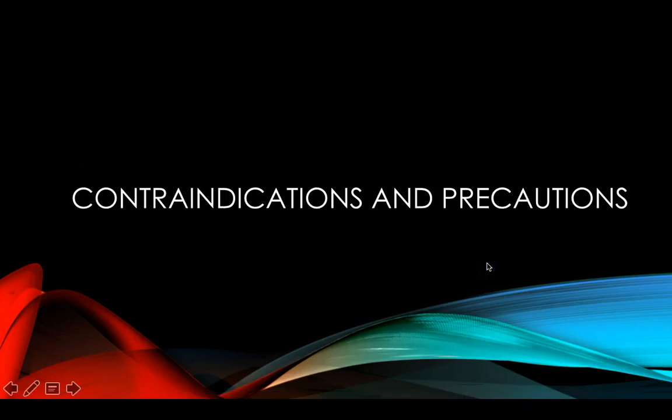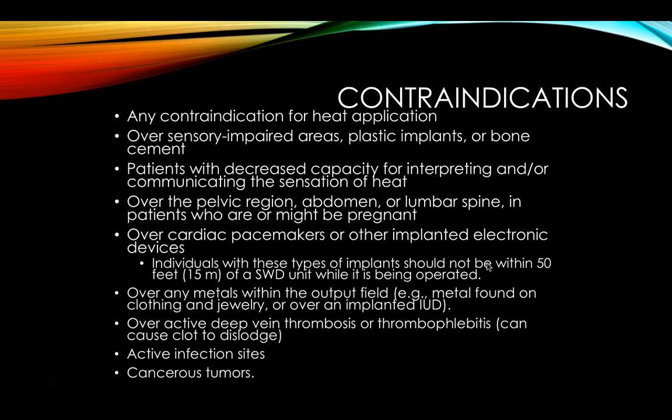Okay, so let's go over contraindications and precautions, because there's a few different ones and more of them than we've had for some of our other modalities. So for contraindications, any of our contraindications for heat application would obviously apply to thermal shortwave diathermy. So look back at your superficial heating chapter and your ultrasound chapter to see those.